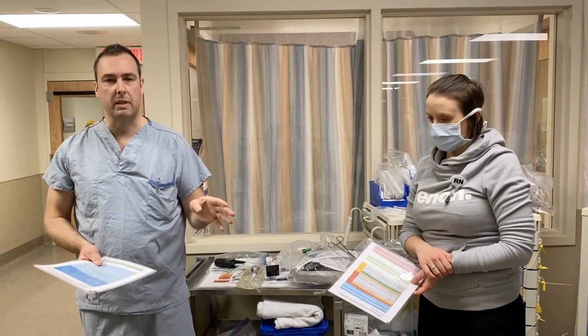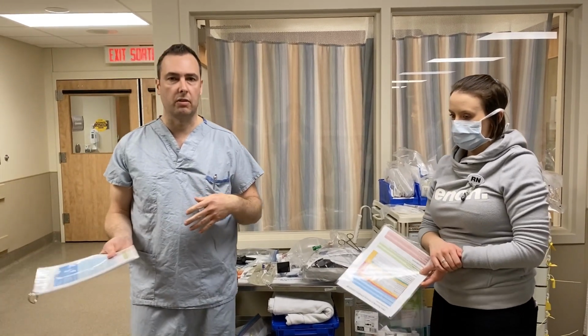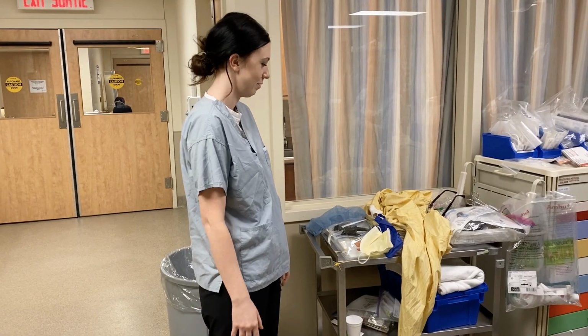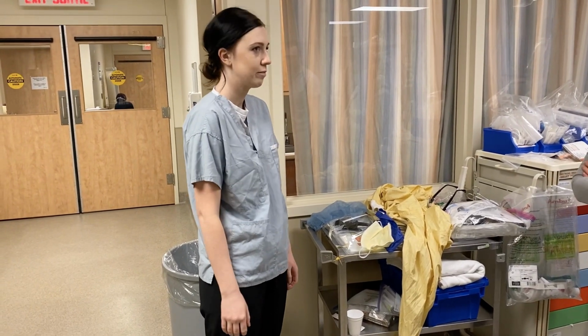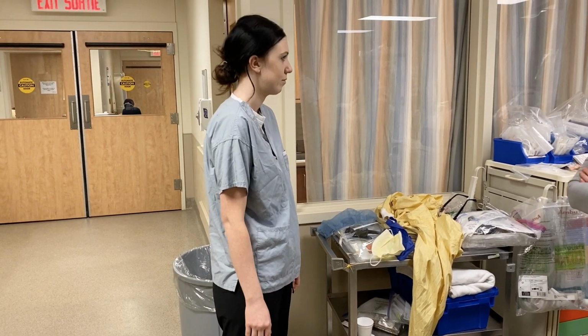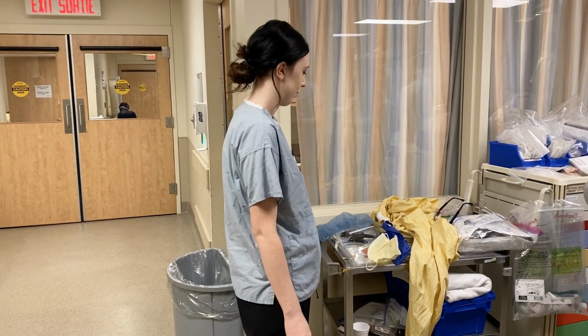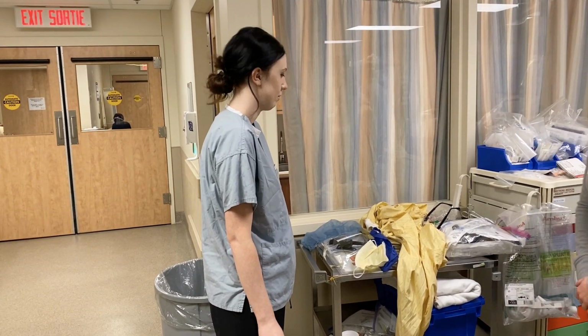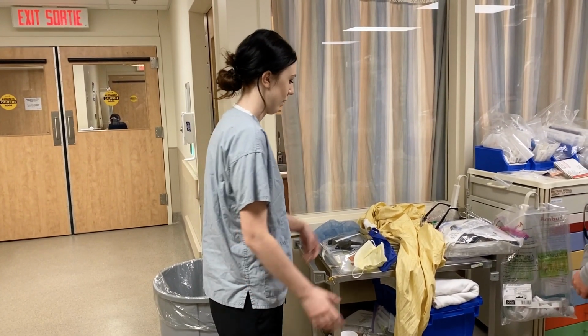Again, for the purposes of this video, only Lacey will get in PPE. The rest of us will stay in scrubs or street clothes, again, to preserve PPE. So Lacey's going to put on PPE. The rest of us are going to stay as is. And Jacqueline is going to act as a spotter. Spotters are extremely important in this situation for both donning and doffing to make sure we're doing it correctly. So take it away, Lacey.